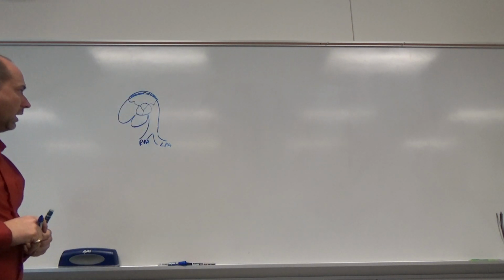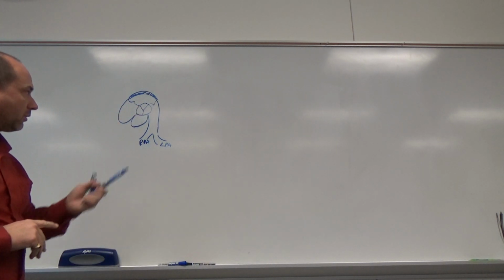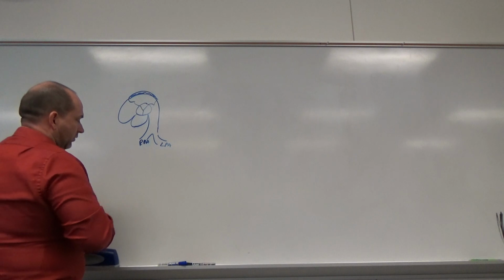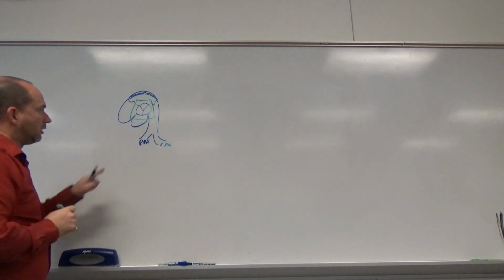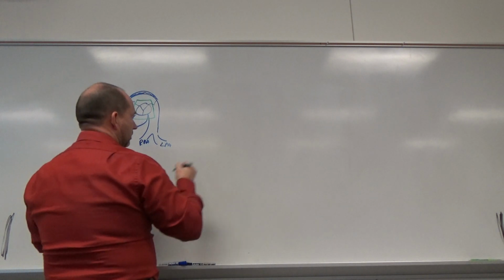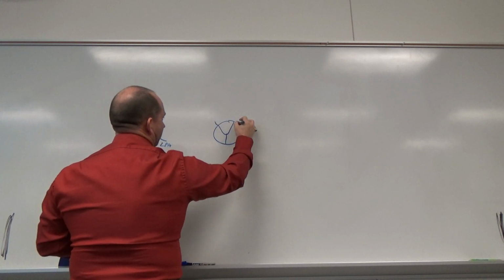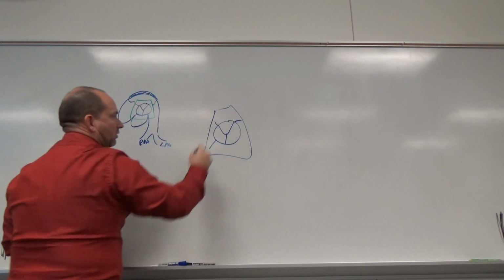So we're not going to do any 2D measurements, but we're going to show color Doppler on these. We're going to show some stuff I'll come up to in a second. First thing we're going to do is zoom up on the valve. So when I'm looking at the aortic valve, I want to zoom over the aortic valve such that I can see the walls that it includes, plus a little bit extra. So make sure that you're not too zoomed up on the valve. Therefore, the valve should look fairly magnified. Okay, and then you're going to see a little bit of valve coming off, and then some septum and stuff like that. So other than that, your box is pretty much this here.